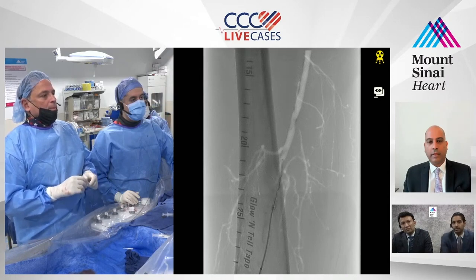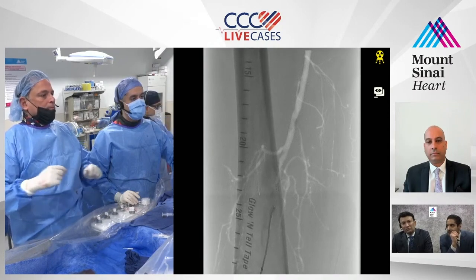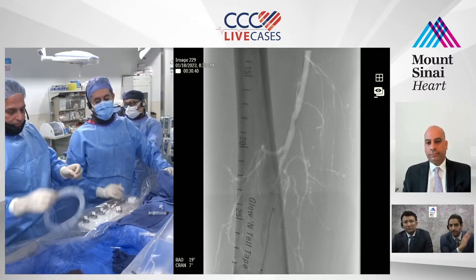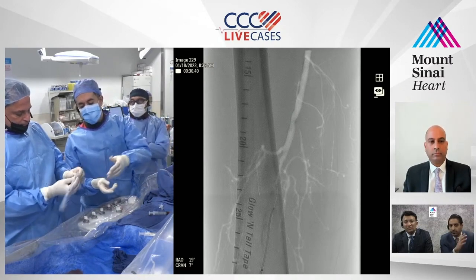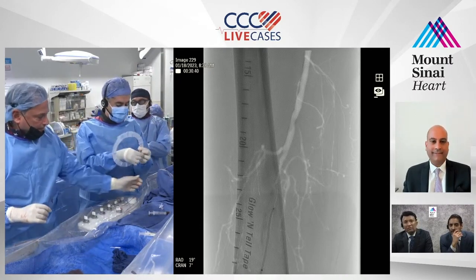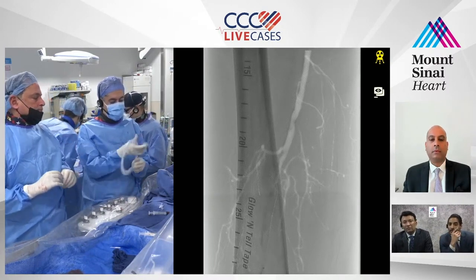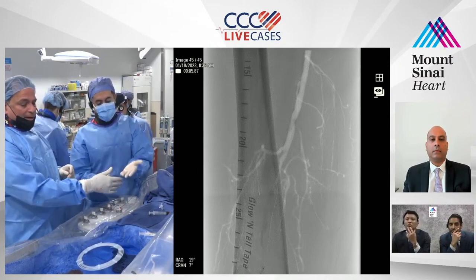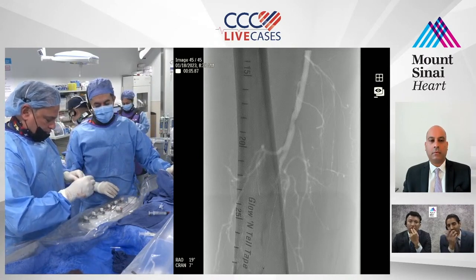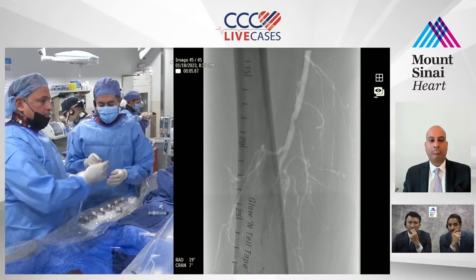Now I will say, I actually have not had too much luck going from a hydrophilic 014-018 to a Confienza and then going to an 035. Traditionally, if I go downwards, I go with the 035s, then maybe to a hydrophilic or CTO wire 014 system. But especially from the retrograde approach, I've not had as much success going from a smaller caliber wire to an 035 system, because I think it's the same problem we see as you create these big loops and big dissection planes.